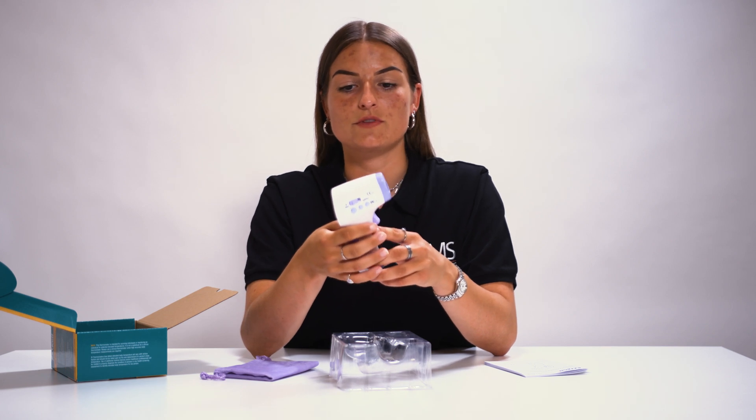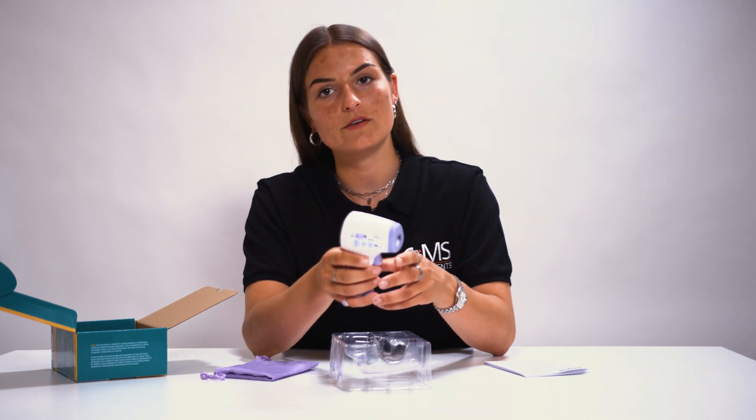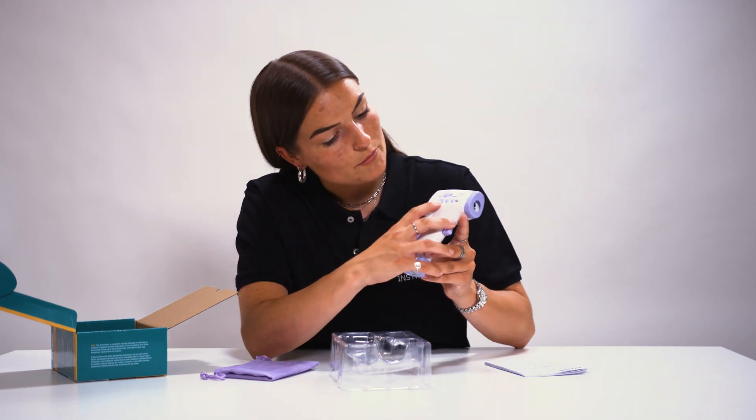Please be aware that the standard temperature settings of this forehead thermometer are in Fahrenheit. So if you want to measure in Celsius, you have to adjust the settings by pressing this mode button.